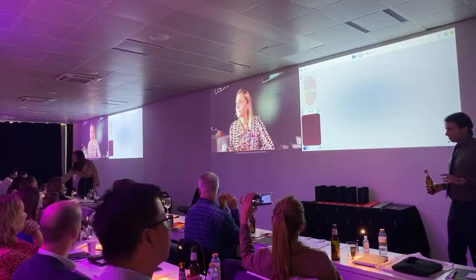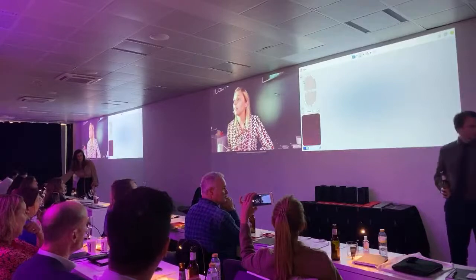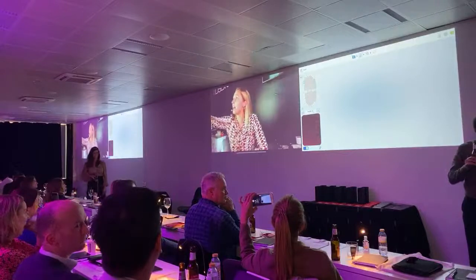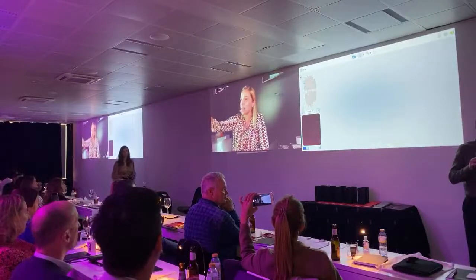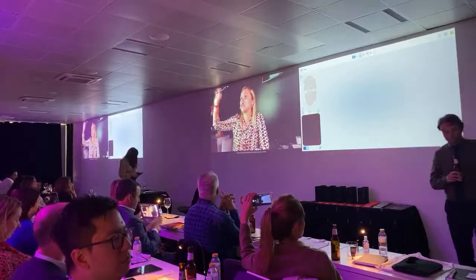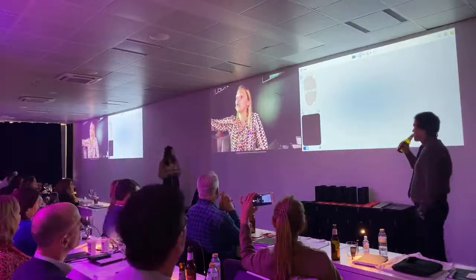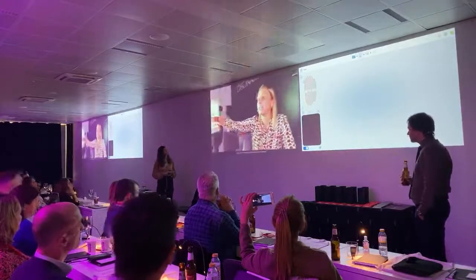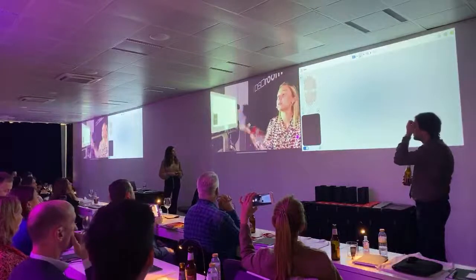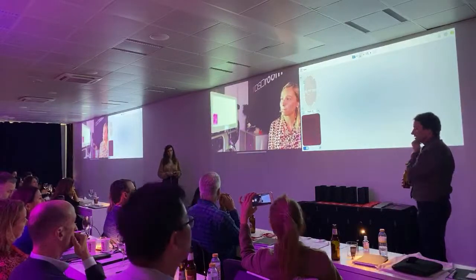The in-house milling one or whatever. What? Same, in the same chair side milling. No, in the chair side milling you have there, I'm not turning back, but in that form, you have pre-op scanning. You click there, and then you're gonna have here in this section, number 1 and 2. And then number 1, you scan the ideal mock-up. And then in number 2, you scan after prep. In the same file. Let me emphasize it, because this is amazing.